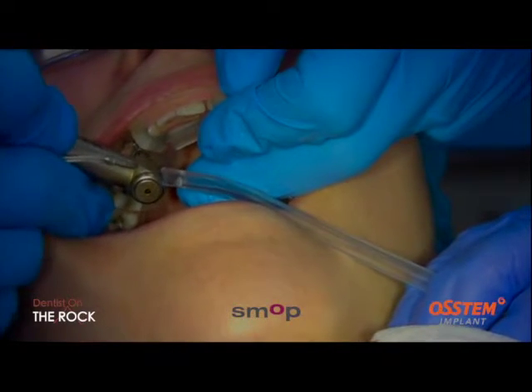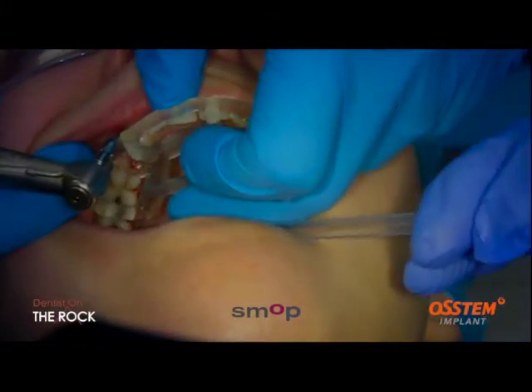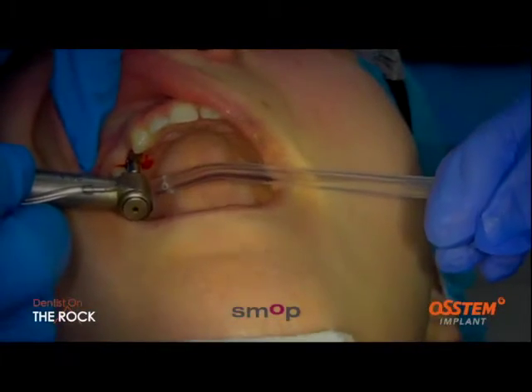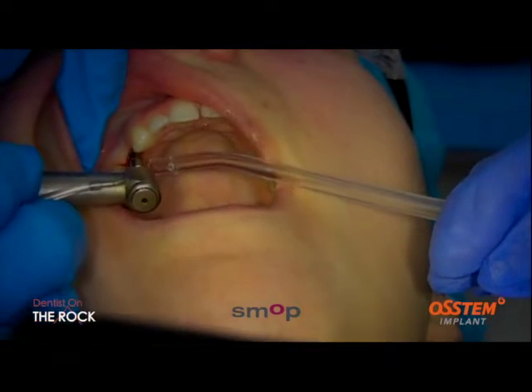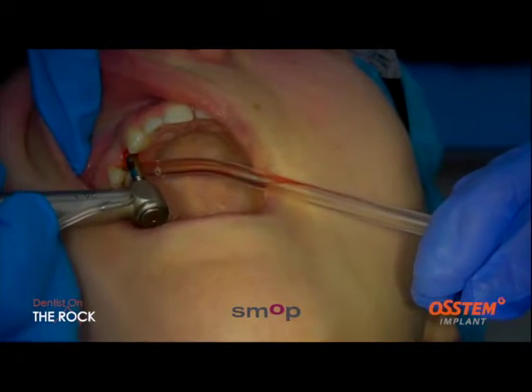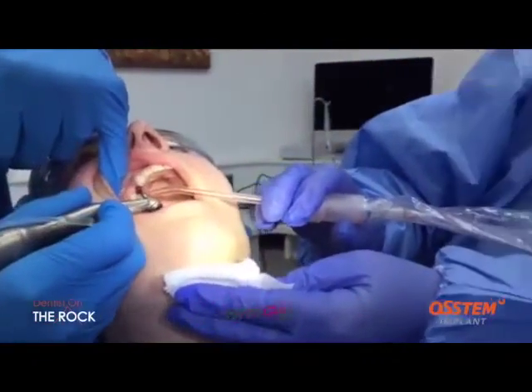Remember what I was saying as well, that the arch, the crest of the arch is never completely flat. So when you see that taking that guide away now, you can see this tissue punch, and you can see that it's pretty much bang on in the middle there. I've designed the guide so that we've got this skeleton margin. I'm going to be replacing this little soft tissue punch later on, so we have more gum.